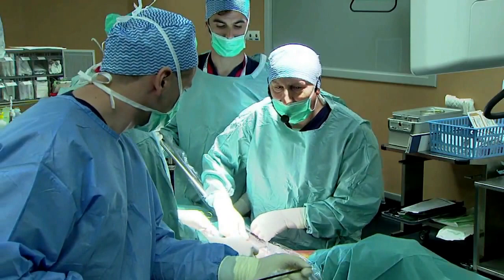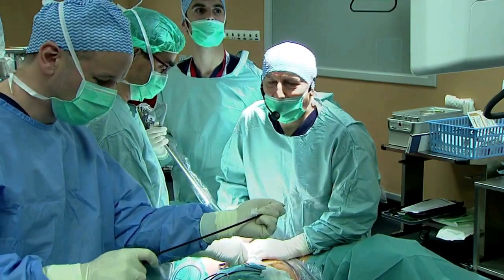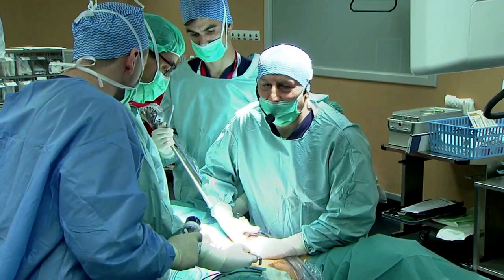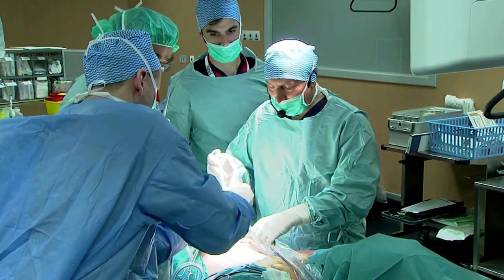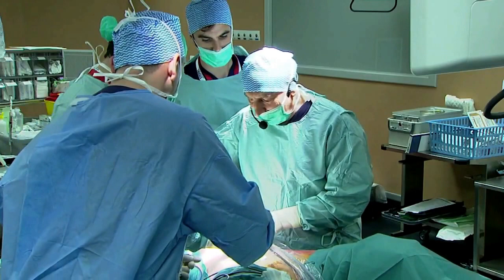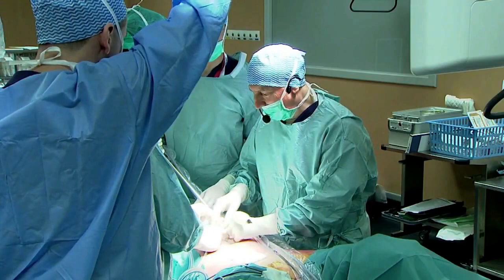So they offer me today the possibility to show the Millin technique that I use with a laparoscopic approach. And as you know, the robotic device could also be used for that. I developed this technique in the last year. Obviously, the approach that I use is an extraperitoneal approach, that I developed over the years for radical prostatectomy. So I performed the first incision below the umbilicus.